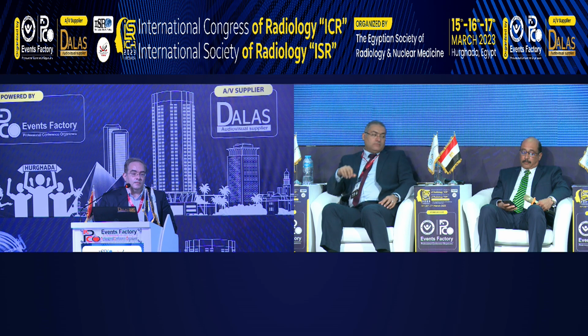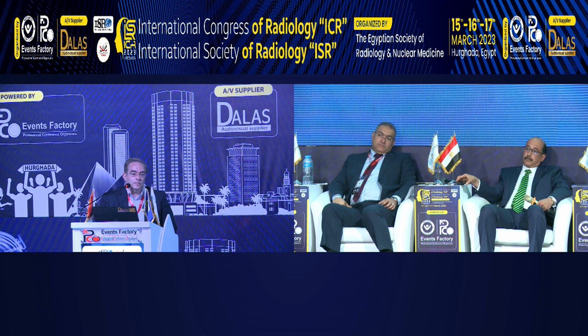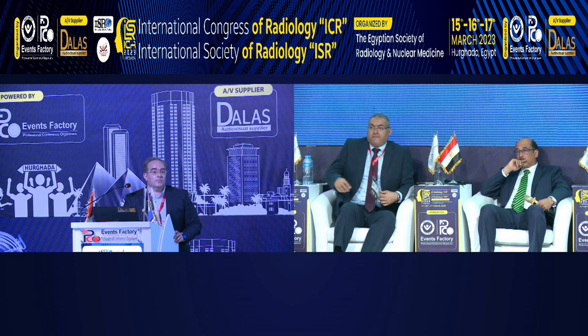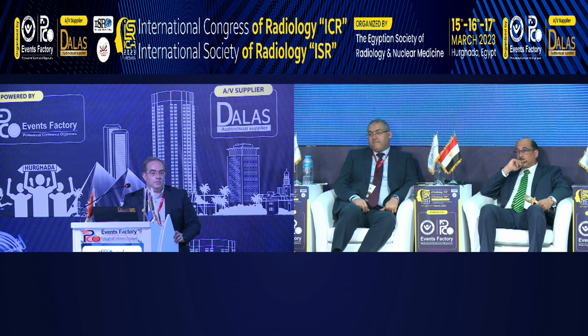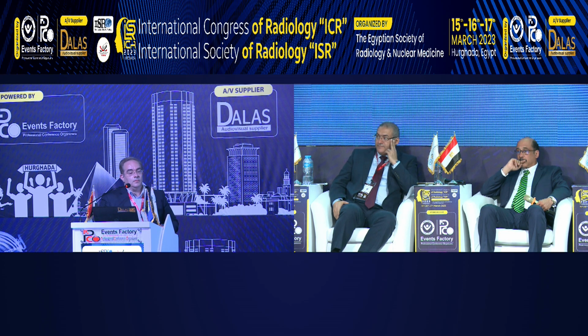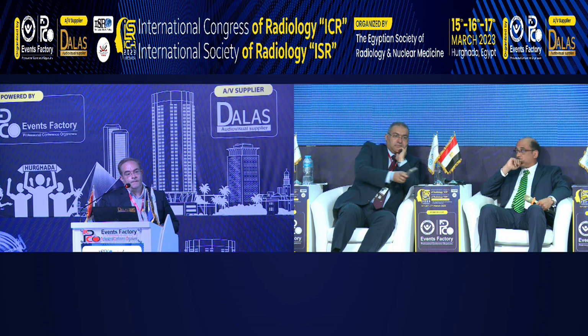The problem with that is, if it is 1 cm, to take a good core biopsy without repeating it, you have to puncture the nodule and stay fixed in it even though it is breathing. Because if I come from the surface and hit parts, definitely a pneumothorax will happen, or if you use a trocar that goes 2.5 cm more than the lesion itself, you will take from healthy lung and cause a pneumothorax again. So how can we avoid needing to fix the tip of the needle, which is very difficult in a case like the last two you showed, without pushing or displacing a nodule during the procedure?